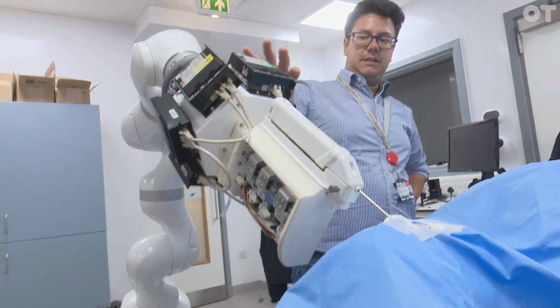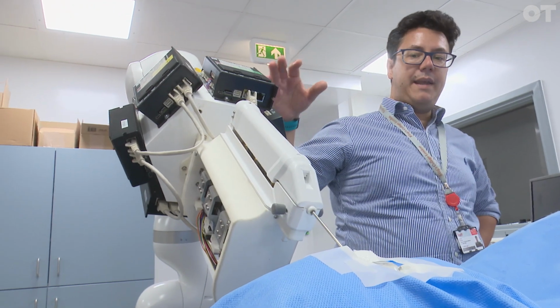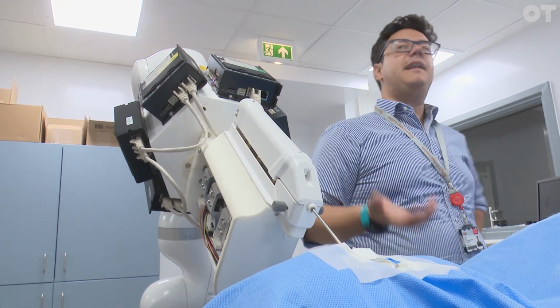Viper is a good name and a bad name. It's a good name because it's a snake, and what we have is a snake-like robot, so it has this flexibility. It's a bad name because it's a venomous snake, but what can you do? But cool, it actually stands for something. It stands for Versatile Intraocular Precision Enhancing Robot. And this is exactly what our device is doing. It goes inside the eye and increases the performance and the dexterity of the human surgeon.